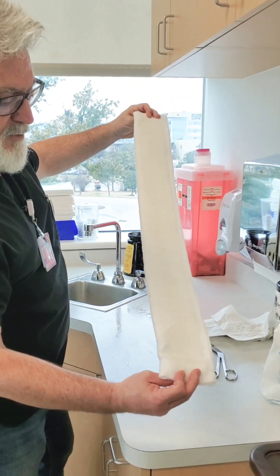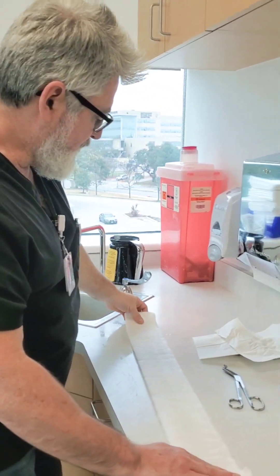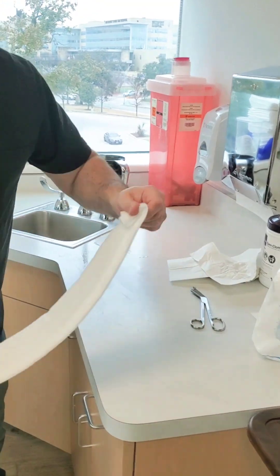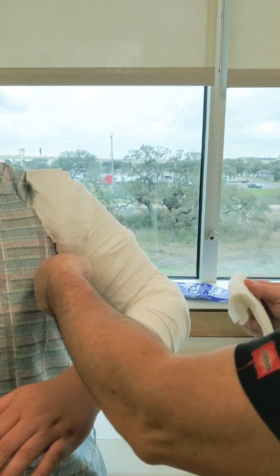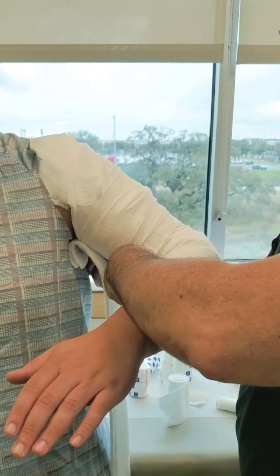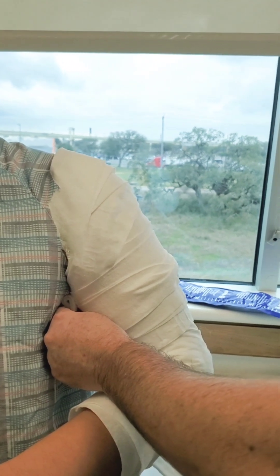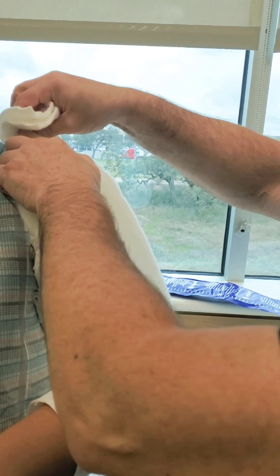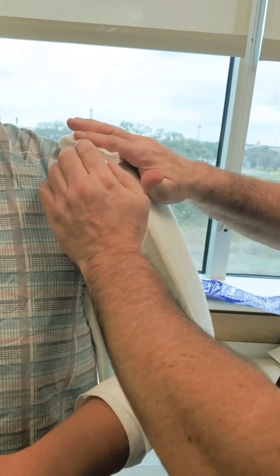The dry side of the ortho glass goes up against the cotton; the wet side faces outward toward the ace wraps. I'm going to fold over the edges on purpose — one, because we're working near the axillary space and I don't want any chance of this poking his armpit; he's already dealing with a fractured humerus. Bring it directly up and right over that spot where we did all the padding. Fold just a hair more, and if you're working alone, have the patient help hold it.